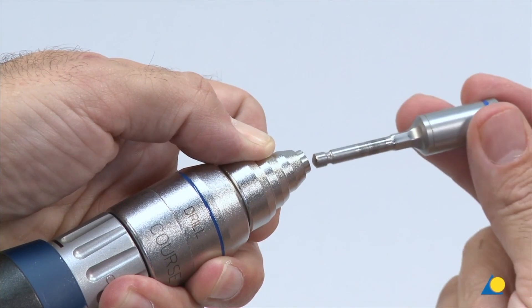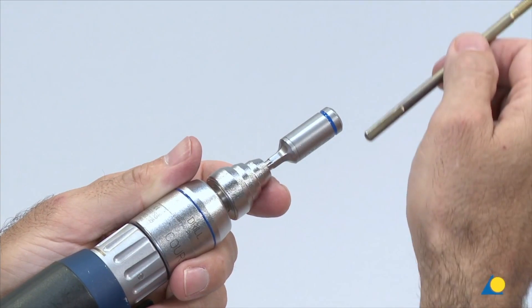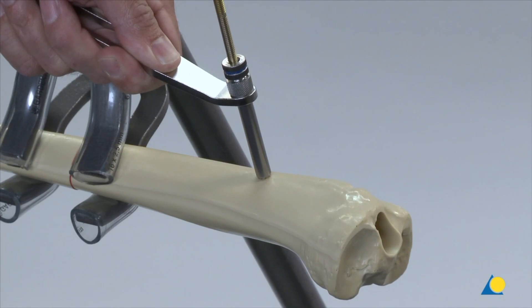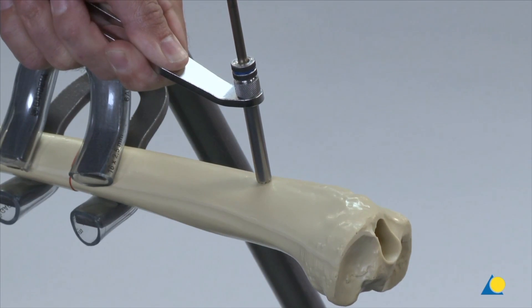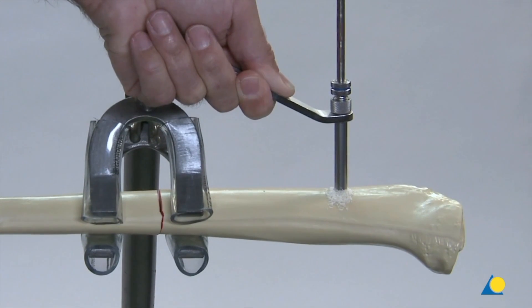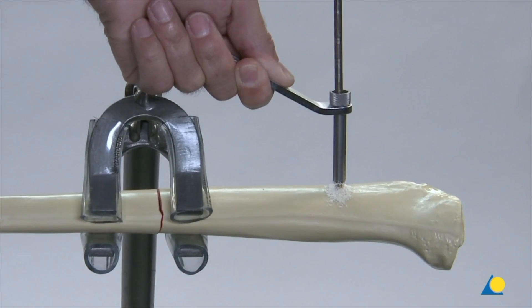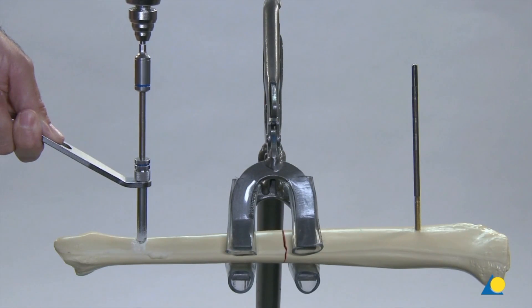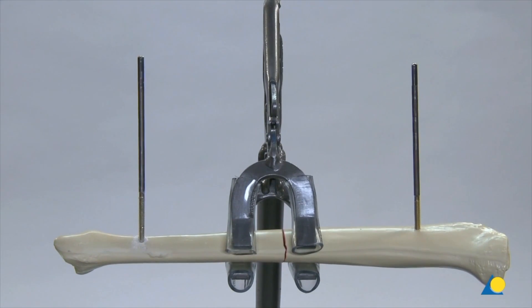The adapter for Schanz screws is mounted in the quick coupling. A Schanz screw is inserted into the adapter and advanced until the tip is anchored in the far cortex. In the clinical situation, irrigation is recommended. Once the Schanz screw has been placed, it is released from the adapter and the drill sleeve assembly is removed. The second Schanz screw is inserted in the distal fragment and must be positioned in the same plane as the first. The image intensifier is used to check the final position of the Schanz screws.